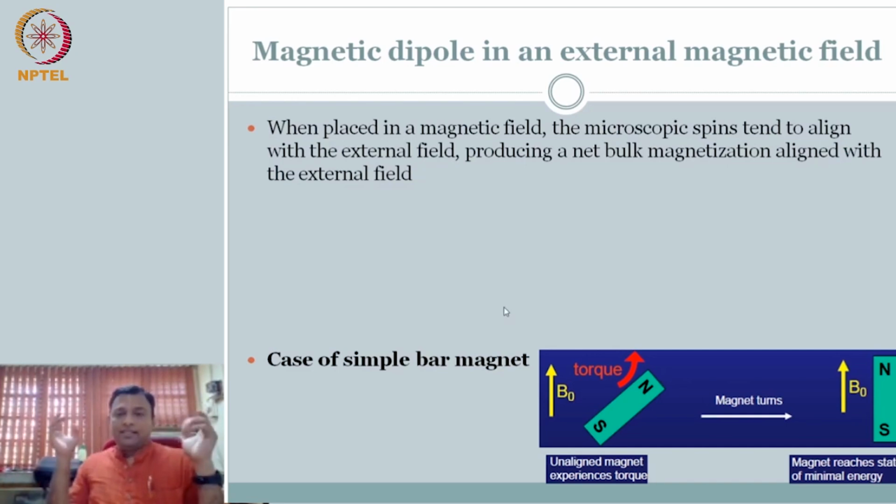Well, your first guess, just because there is an analogy drawn, is that the spinning nuclei will also align themselves to the direction of the external magnetic field. And that is partially correct. I mean, it has to behave very similarly. But notice there is a big difference between the case of the bar magnet and the spinning nuclei that we use for an analogy.